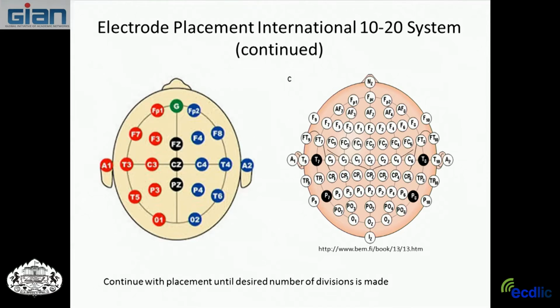We went over the 10-20 system of electrode placement. And on Friday, we had the wonderful opportunity of going to the lab and seeing how an EEG cap was placed and how this 10-20 system works. You can have either a cap that helps with the placement, or you can have a tape measure and have someone measure all these spaces of the electrodes.